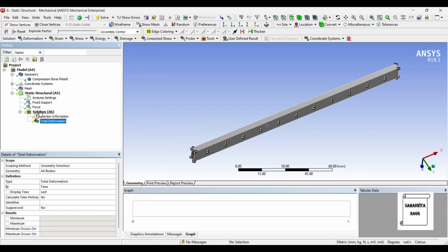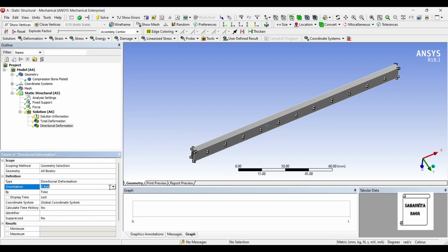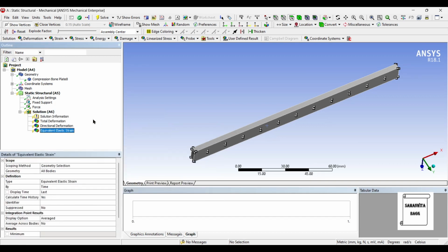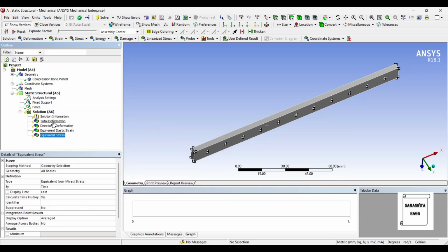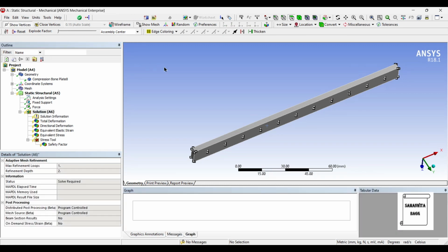deformation total. I also want to see the deformation directional along the y-axis. Next, I'll insert strain equivalent. I'll insert stress equivalent. I'll go to tools and insert stress tool so that I can see the factor of safety of the body. Then I'll go to solution and solve.